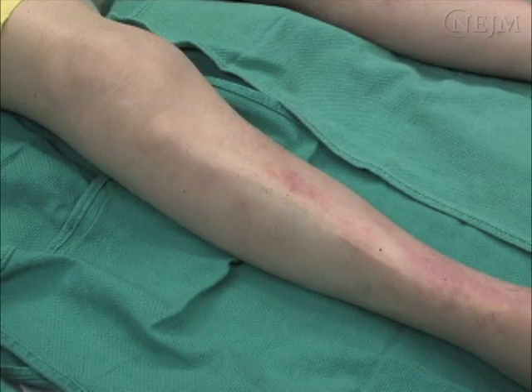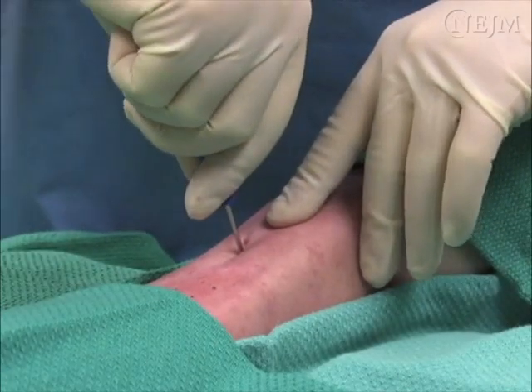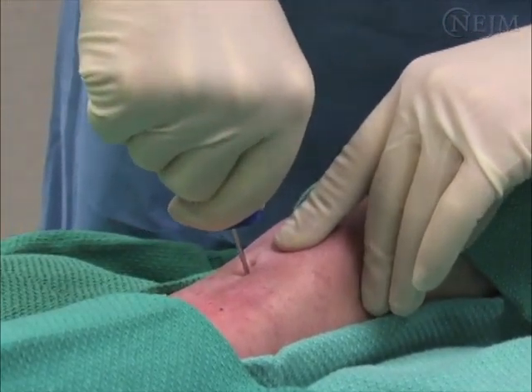When a mechanical insertion device is used, the anteromedial surface of the proximal tibia is the preferred site of insertion because it is easy to locate, it presents a flat, wide surface for insertion, and the subcutaneous layers overlying the bone are thin. If the intraosseous needle is inserted manually, the medial aspect of the distal tibia is the preferred site because of its thin bony cortex and the small amount of overlying tissue. A substantial amount of force and a large bore needle are required to manually penetrate the bone.